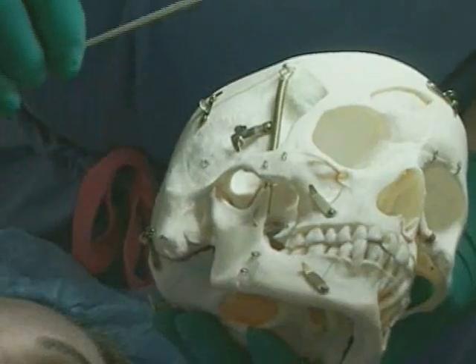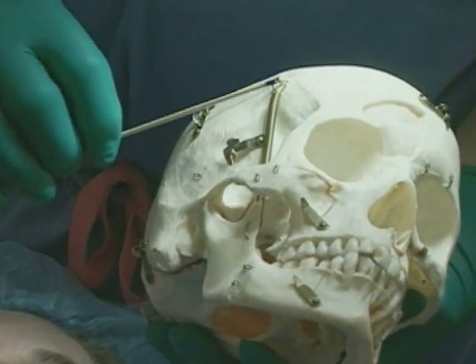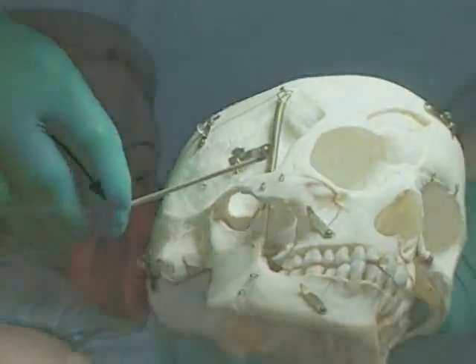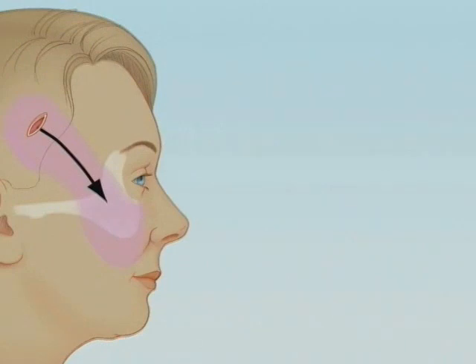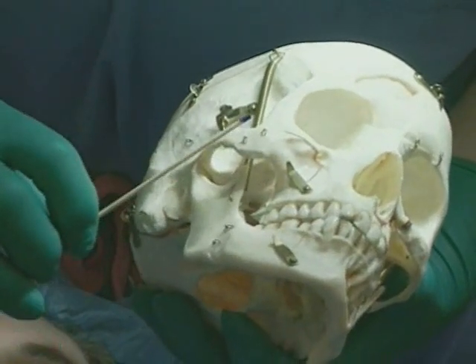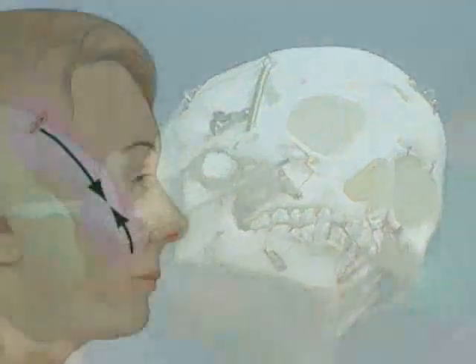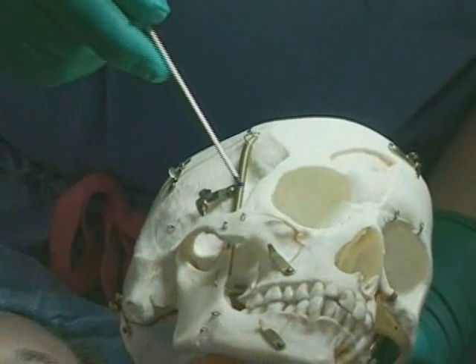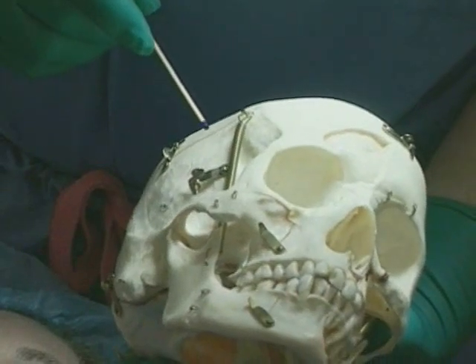So when we're dissecting, we'll dissect down and elevate over the superficial layer of the deep temporal fascia, elevating that fat pad down to the zygomatic arch in this area, and we know the nerve is above us. In this area, we're going to be in a subperiosteal plane, and then we'll want to connect these two, piercing essentially through the periosteum. We'll engage our implant in approximately this area, elevate, affixing to the deep temporal fascia in this area.